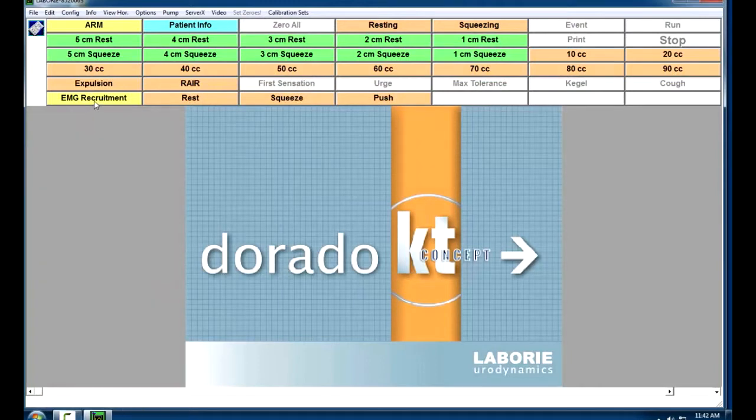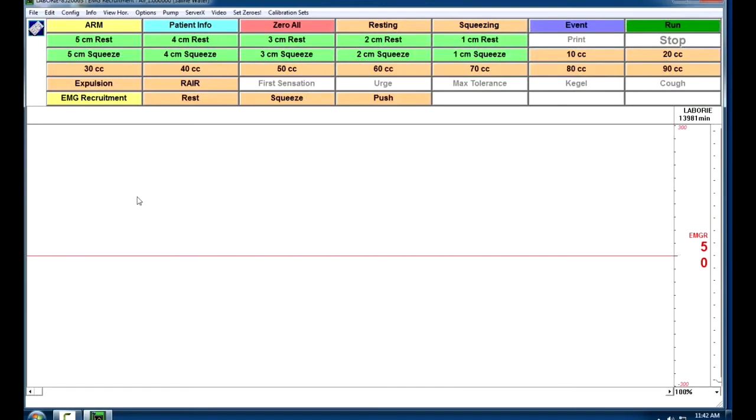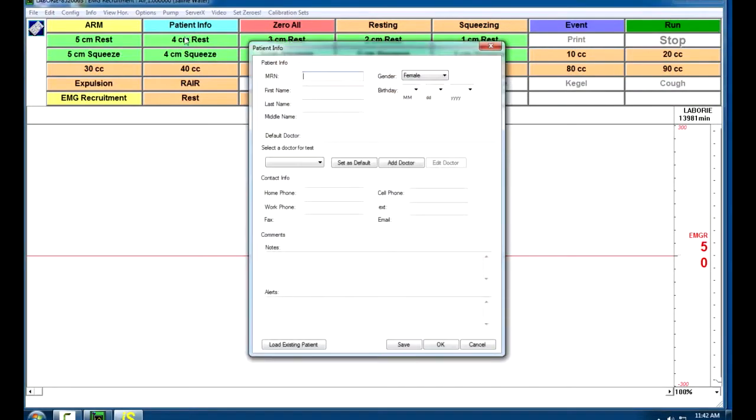We're going to start with the EMG recruitment. We'll click on this button on the desktop. At this time, I'll go ahead and enter the patient data. You have to put in a medical record number, a first and last name, gender, and birth date. Those are the required fields. The others you can fill in if you wish, but are not necessary.